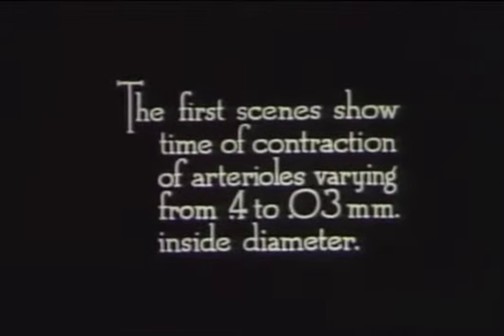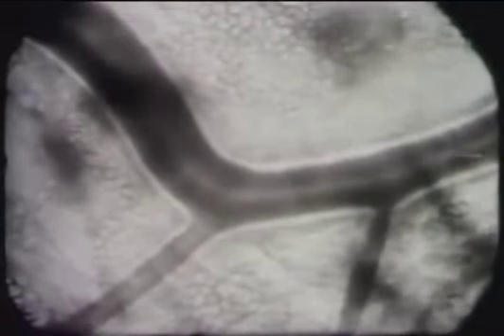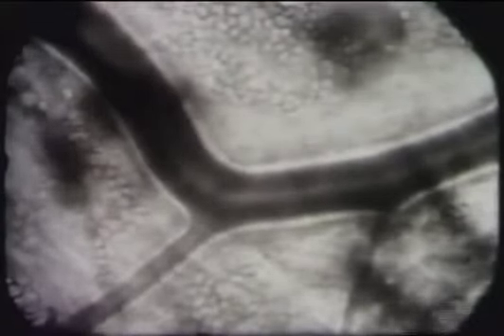The following scene shows examples of vasomotion. What also can be seen here is the evidence of streamlined flow in the larger arteriole in particular, with the light area and the peripheral plasma layer you can see at the edges. But it's a very good example of vasomotion in these vessels.